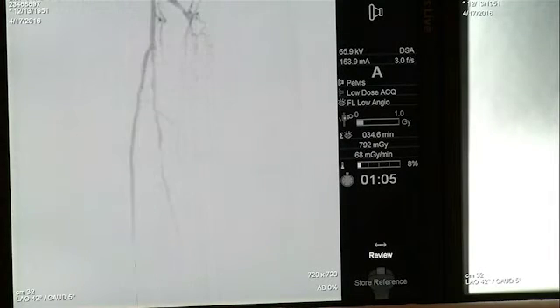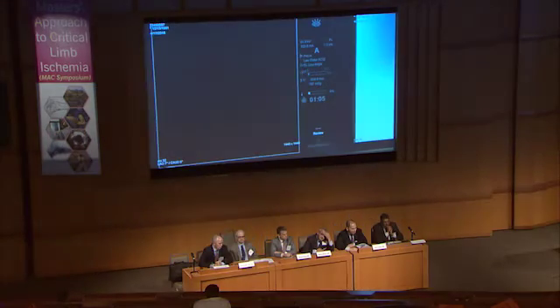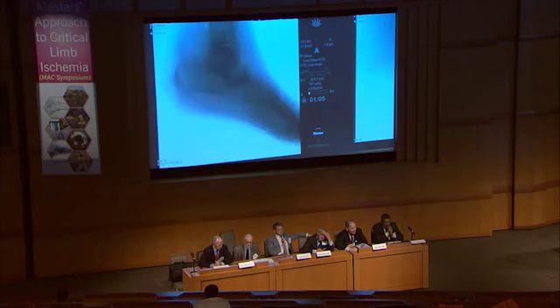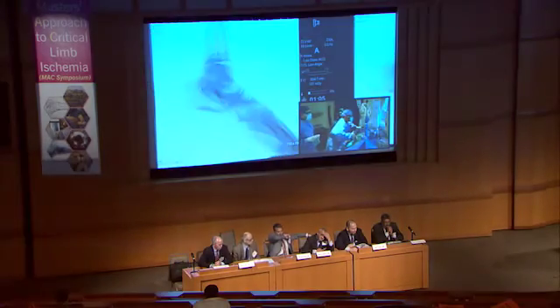Wonderful. Alec, go ahead. The only thing to consider is the foot and what the foot looks like, because the pre-interventional foot angiogram shows that the dorsalis pedis was the main vessel to the foot. So I would really want to look at the foot and make sure that you've really revascularized the posterior foot. Otherwise, I would definitely intervene on the AT.